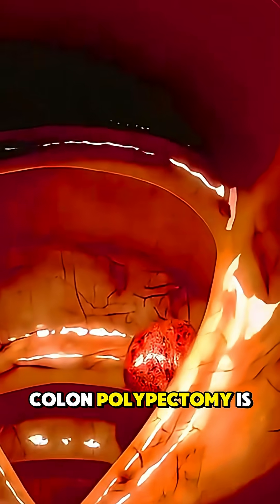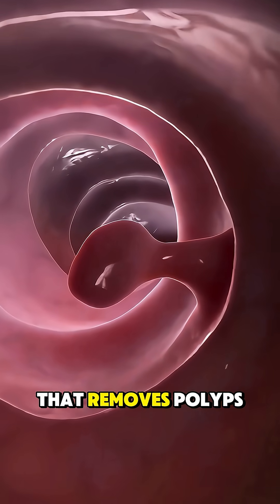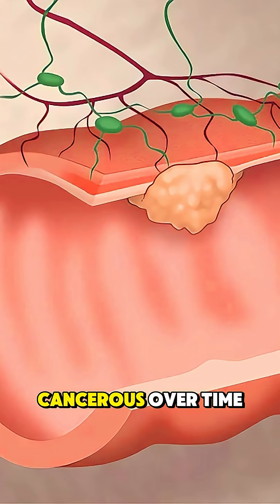Ever wondered how colon polypectomy is performed? It's a common, life-saving procedure that removes polyps from the colon — small growths that often show no symptoms but can turn cancerous over time.